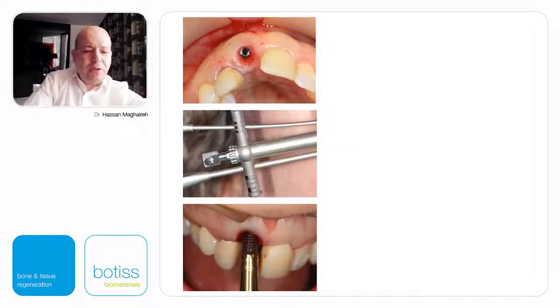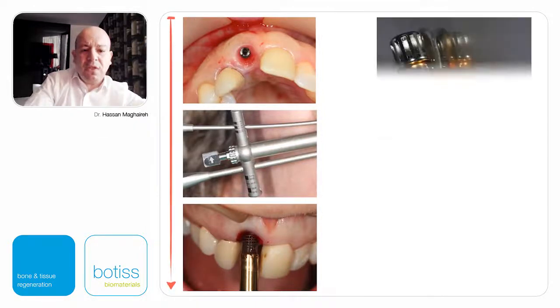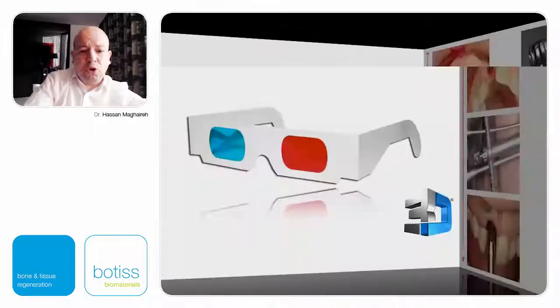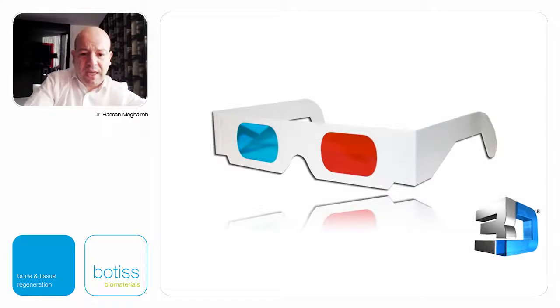We went through different treatment options with this lady, and we decided that we will have to remove this dental implant and give this lady a fresh start. And this is what we did. We used this reverse torque kit, and we went for about 35 Newton centimeter in reverse, and we managed to get the implant completely out. And obviously, in my view, this is the only correct way of managing this case.